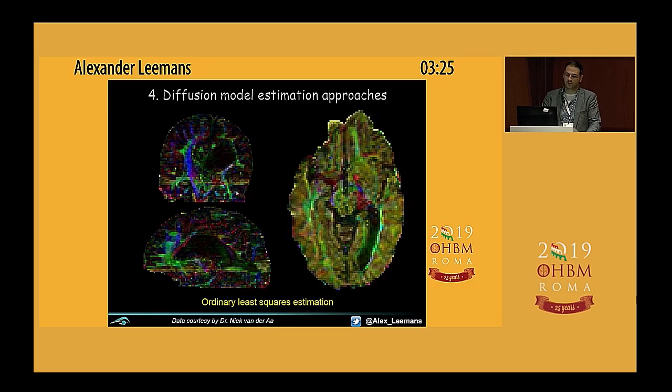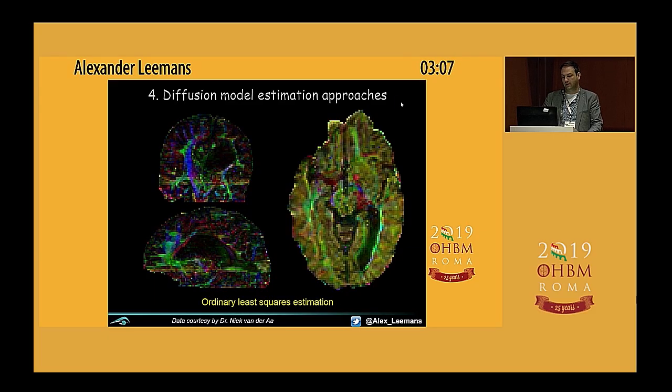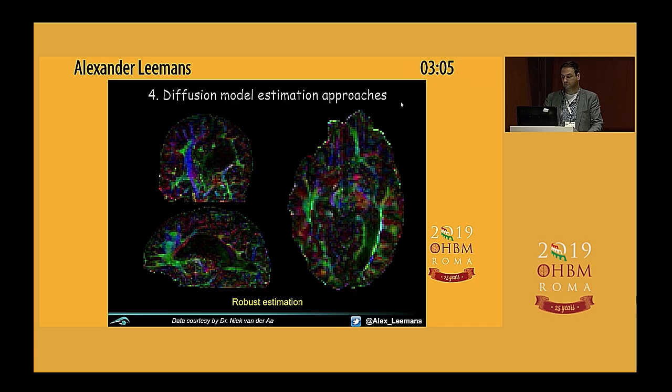So here was an old case. This is what the scanner console provided. It was a child with a lesion, moving a lot, artifacts. Obviously, I kind of cherry-picked my axial slice over here, but if I then correct it, instead of using an ordinary linear least squares, but with a robust estimator, I'll get this, right? So hopefully you can appreciate that this one looks a lot better than this one, okay?